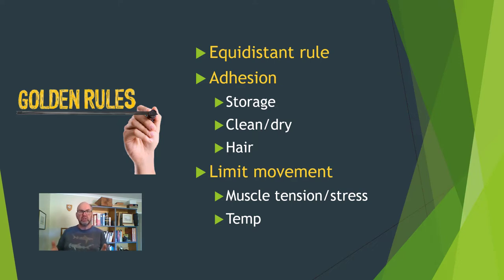It's also important to make sure that the person's clean and dry where the electrodes are going on. It's quite difficult when someone's sweaty, but it pays to towel them down. And the other thing, it's pointless putting electrodes over very hairy bits, because the electrode adhesive and the gel will stick to the hair and not to the skin. And again, that makes us very prone to having artifact or just a poor signal.